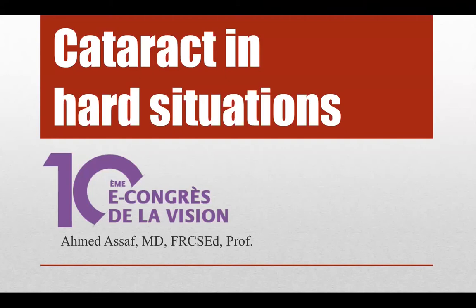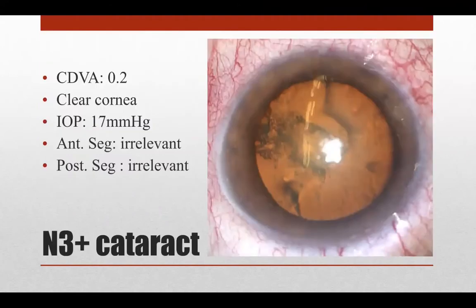I'm going to drive you for the next 15 minutes through three cases of different scenarios of hard situations in cataract surgery. So let's start with case number one. It's a routine cataract surgery with clear cornea and irrelevant anterior and posterior segment examinations.